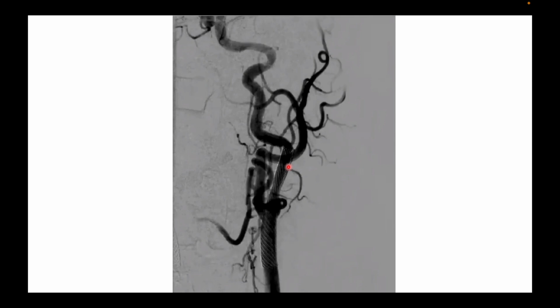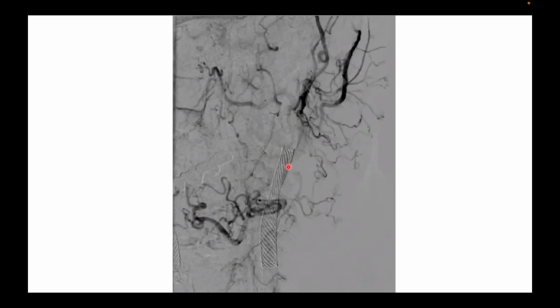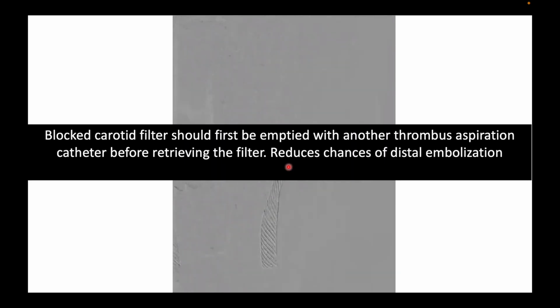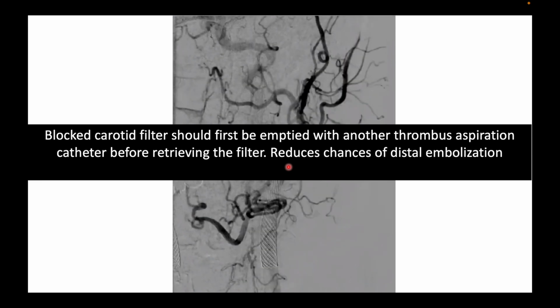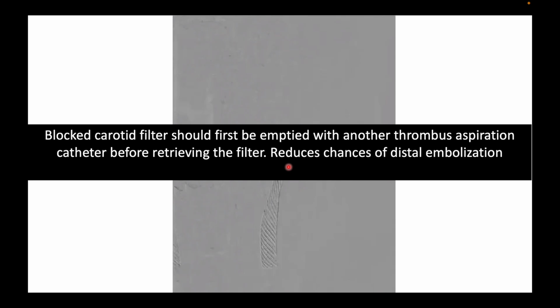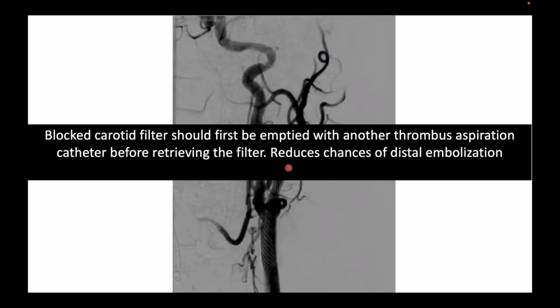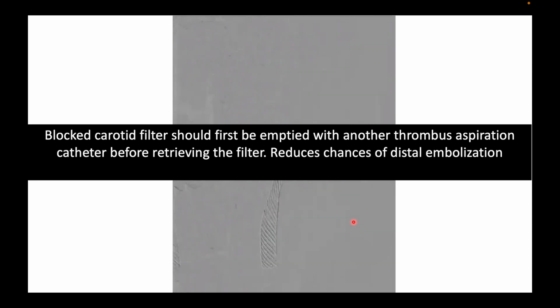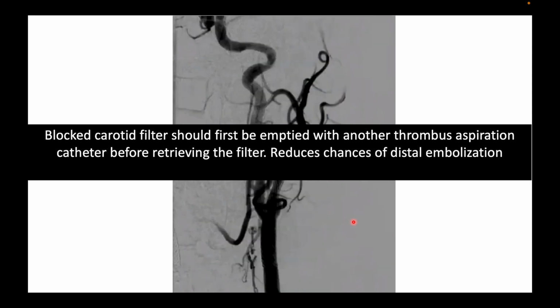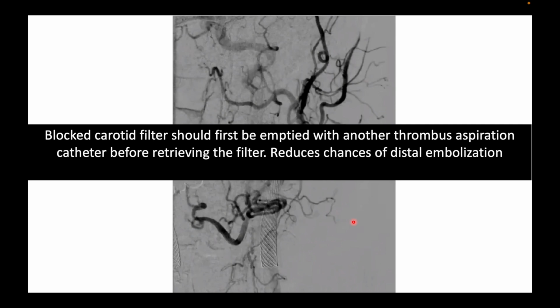And that's the final view. So the lesson learned from this case is that the blocked carotid filter should first be emptied with another thrombus aspiration catheter before retrieving the filter. This will reduce the chances of distal embolization. If you've got a choked filter, you've got to aspirate the filter, empty it first before you actually retrieve the filter.